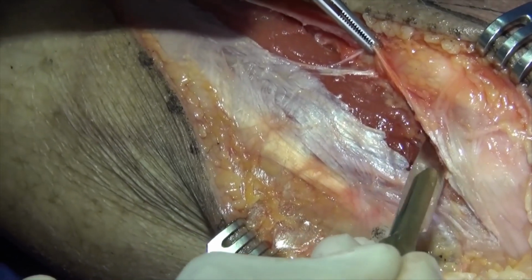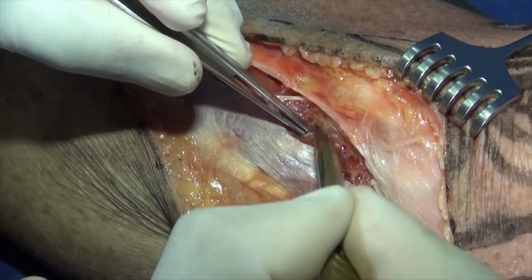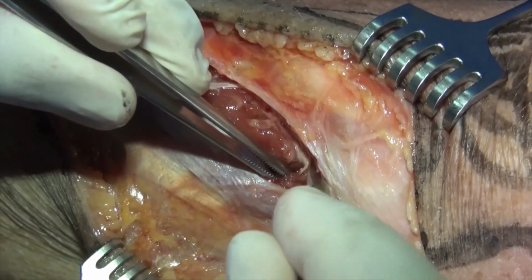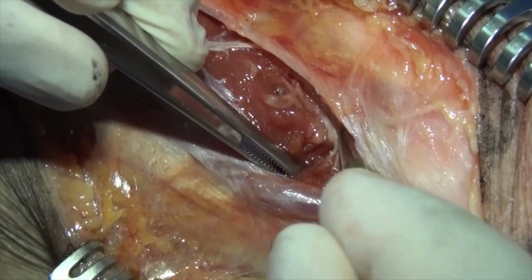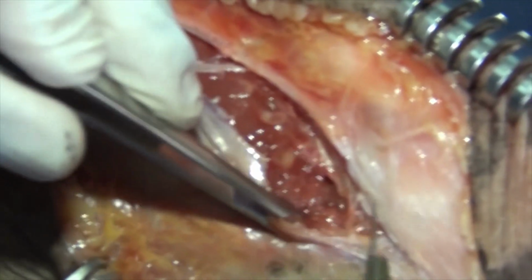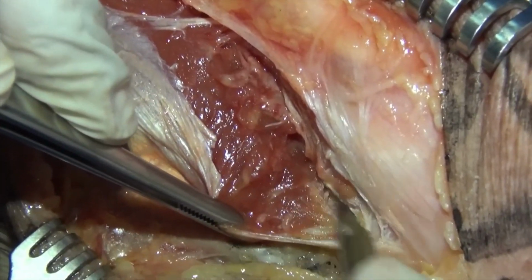And the next step is you take your extensor muscles off from the tibial condyle. You can use sharp dissection, which I think I prefer, or you can use an electrocautery. I don't have much of a choice at the moment. And you peel this back from Gerdy's tubercle.